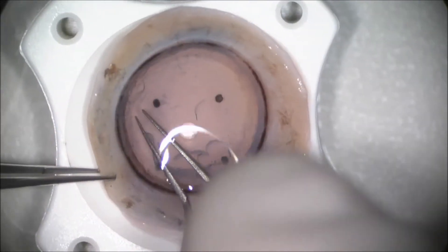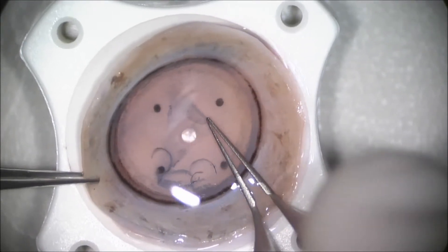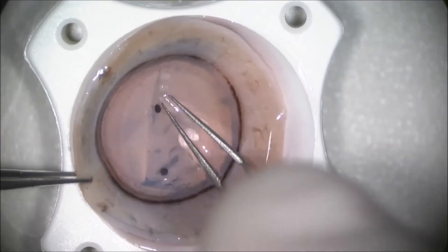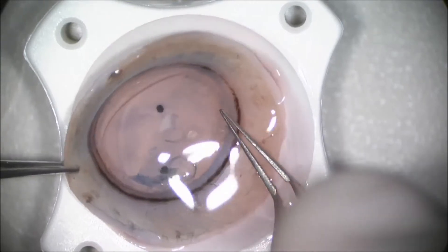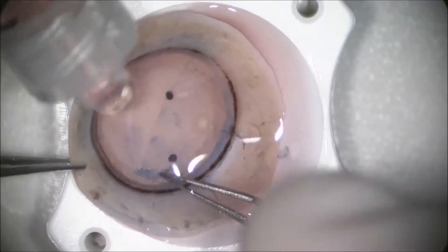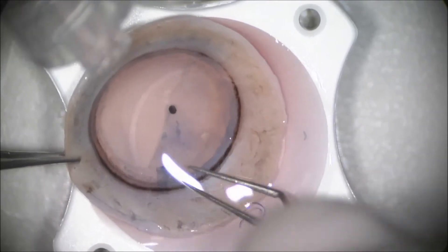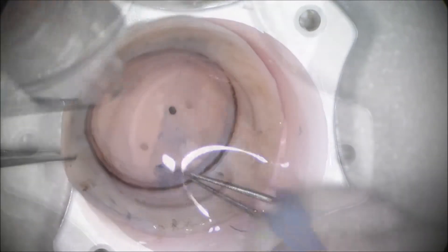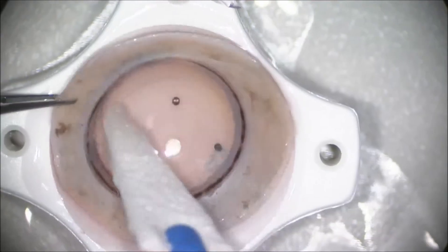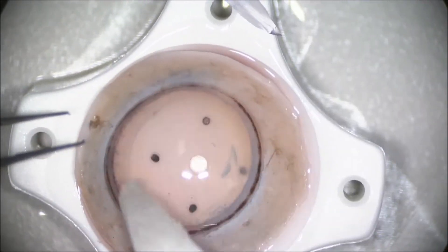Now once that's done, you're able to grab one edge of Descemet's membrane and slowly peel across. Once the Descemet's membrane has been peeled across, we use a Merocel sponge to wipe away the residual Descemet's fragments. We use a Merocel sponge because you don't want fibers to get in there.